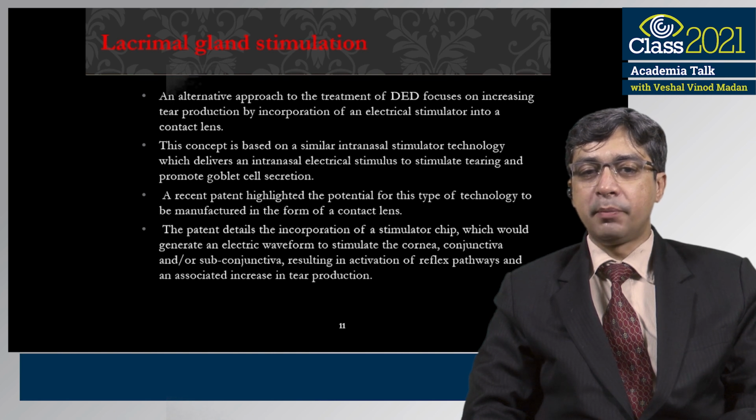Recent patents highlighted by many companies have shown that this is a promising kind of technology which can be used to alleviate dry eye by stimulating the lacrimal gland.